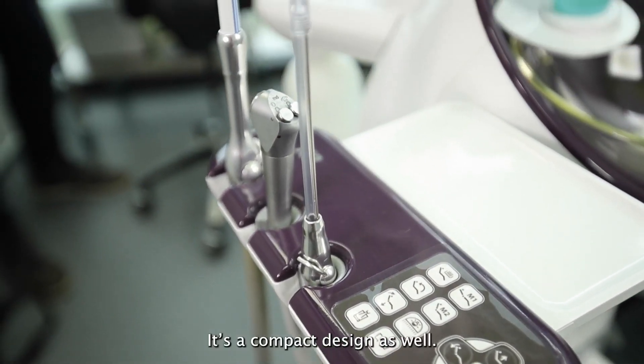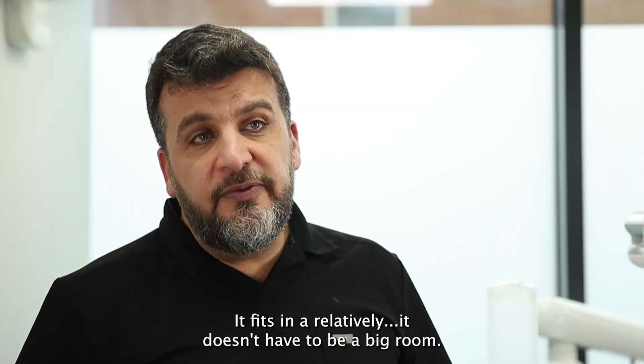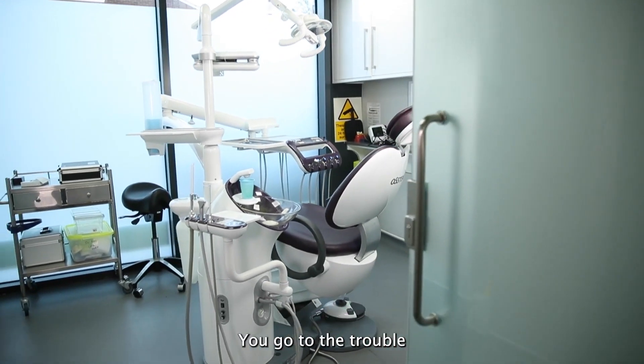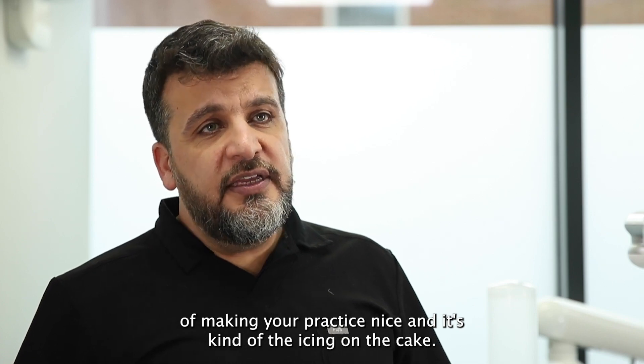It's a compact design as well, so it fits in a relatively small room. Even the motion is all nice and quiet and smooth. You go to the trouble of making your practice nice and it's kind of the icing on the cake.